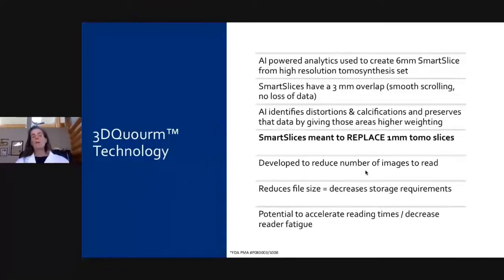So overall, we wanted to look at whether this can really help read times. Again, the big complaint about tomosynthesis is it takes longer for us to read. So if we could decrease that read time, would that not be a huge advantage? And then also reader fatigue. If I have a tough case at the end of the day, it's often a little bit harder to get through as opposed to the beginning of my day where I'm more fresh.